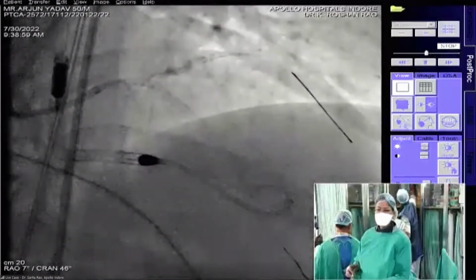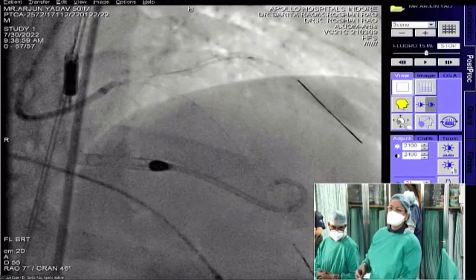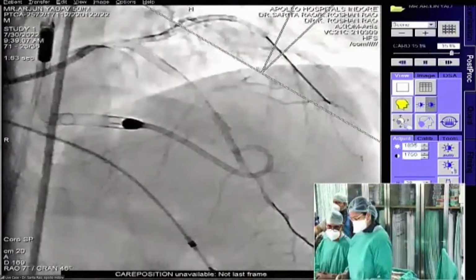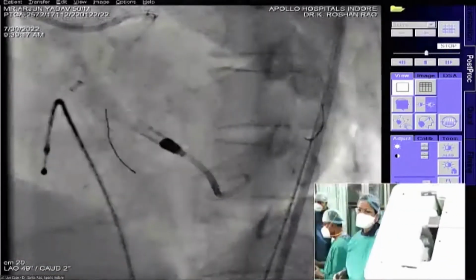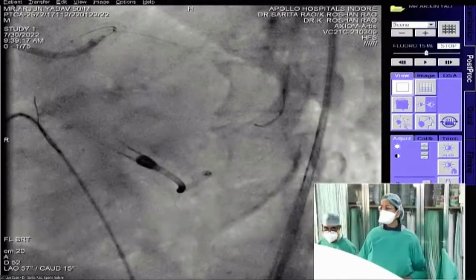So I make a final decision with the provisional. This is provisional. When to do a balloon or a stent for the ostial circumflex depends upon whether there is threatened dissection, the result looks less than good, TIMI 2 flow, or more than 90% stenosis. Here, this patient does not meet all the criteria. So I'm actually comfortable walking away, and in case the patient comes back, they will come back. But I don't think I'm forced to do anything.